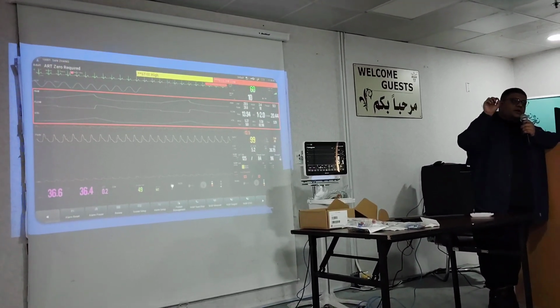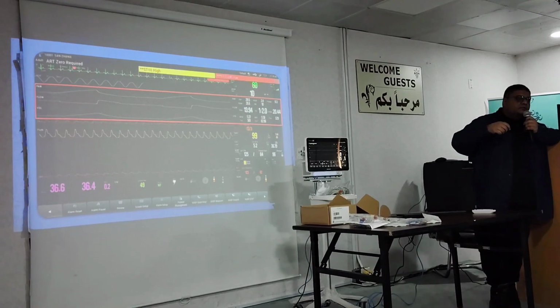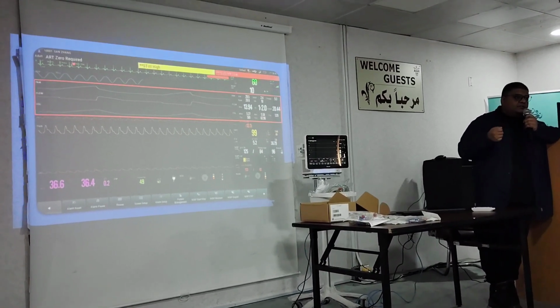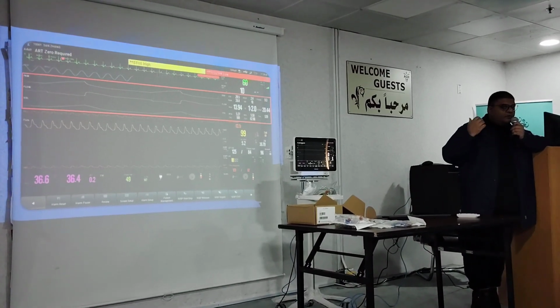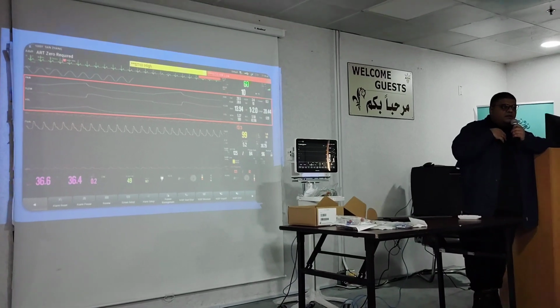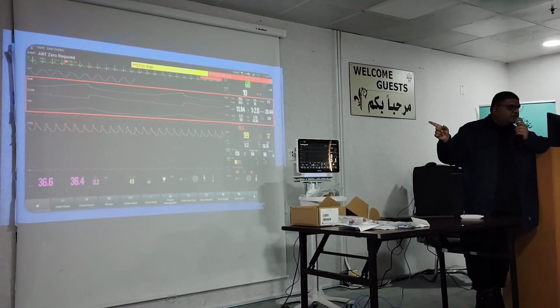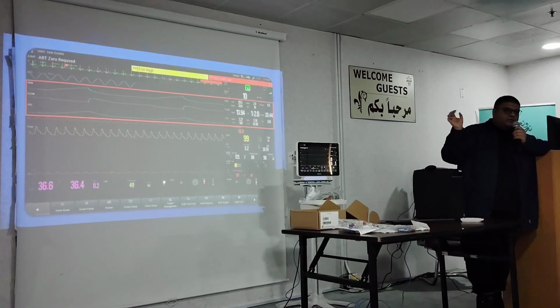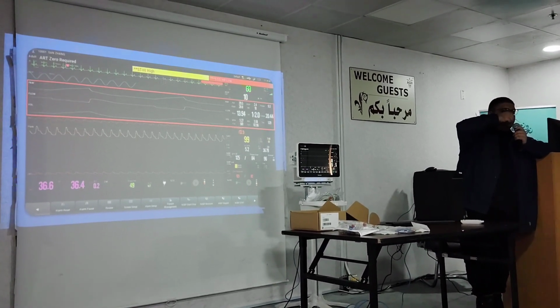So what you are actually observing is what the ventilator is outputting, like what you have set, rather than what the patient is receiving. So if you want to observe from the perspective of the patient, what the lungs of the patient are experiencing, then you need a respiratory mechanics module, because this connects to the Y tube directly over the intubation pipe.